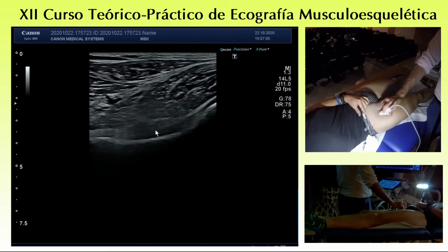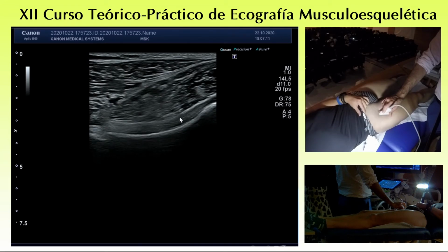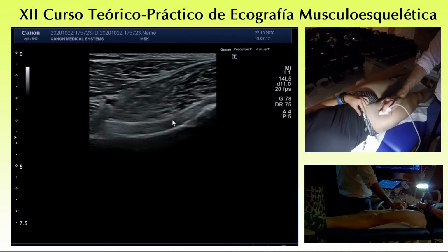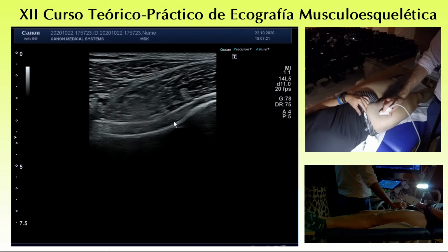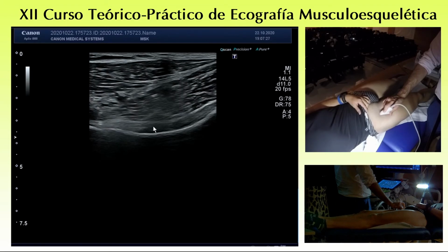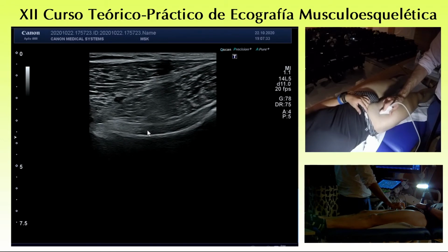It's difficult to recognize the zona orbicularis, but more or less it occurs at the passage between the femoral head and neck. This is the area of the zona orbicularis. But of course, if you perform an injection, you aim to the lower part of the bursa. This one is much easier to get in, and there is not much fluid distension.